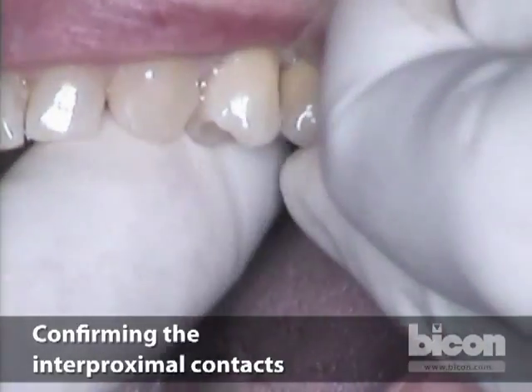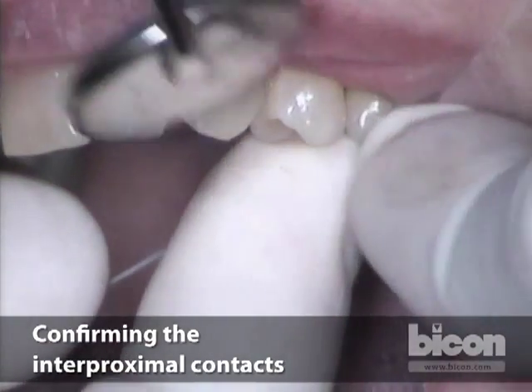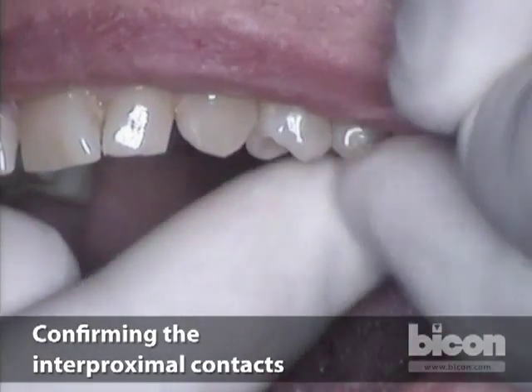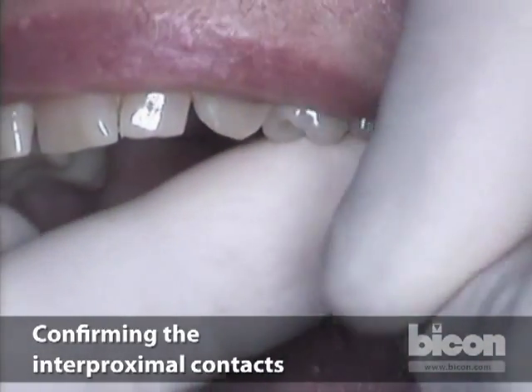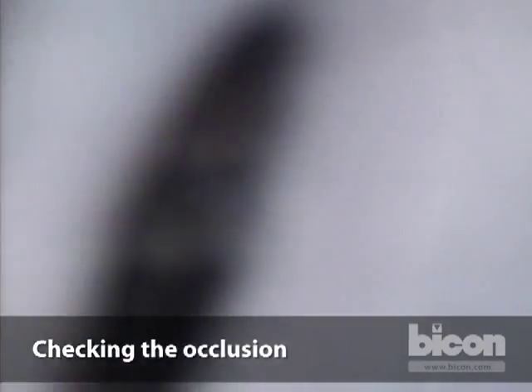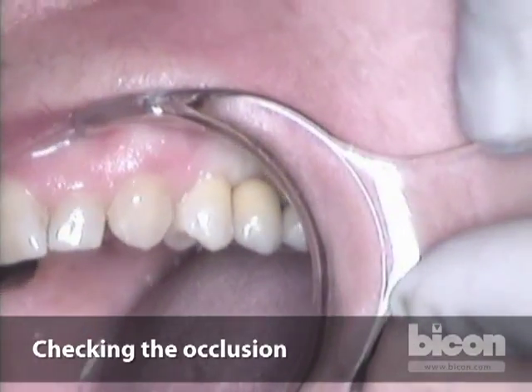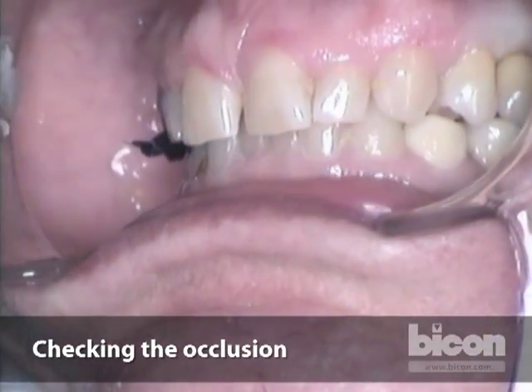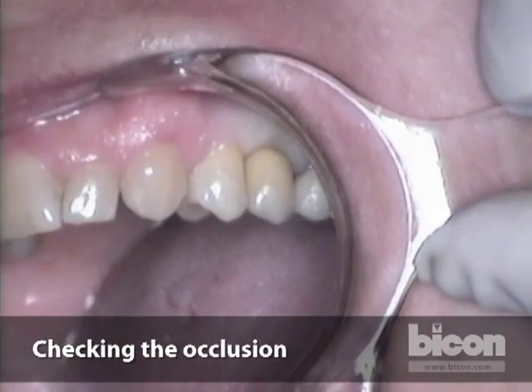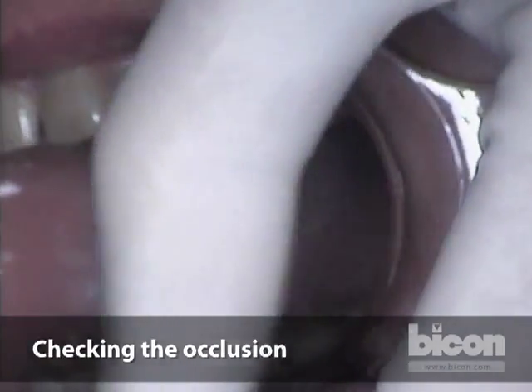We have mesial contact at present. Contact at present distally. First we'll check the occlusion on the opposing side — make sure it is in occlusion. There's contact on the opposing side. Now let's see if it is in occlusion or whether it's hypo-occlusion.